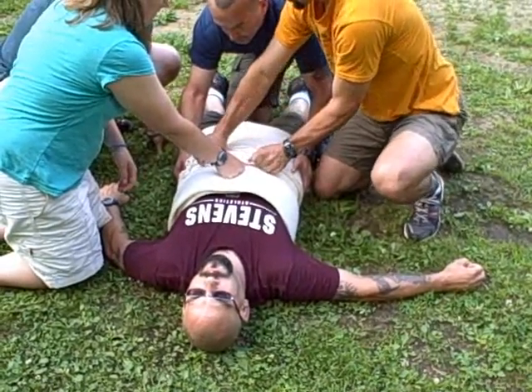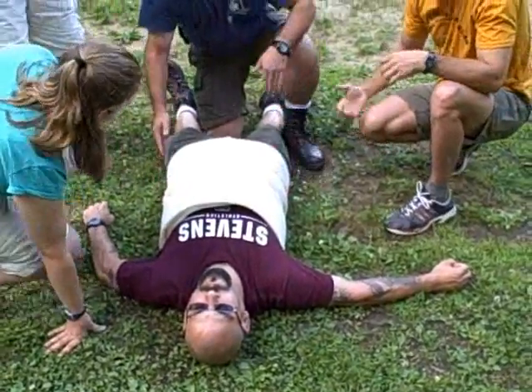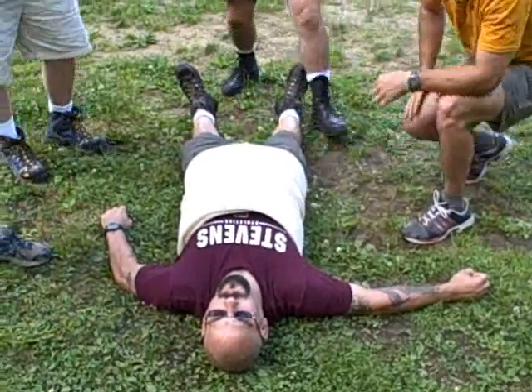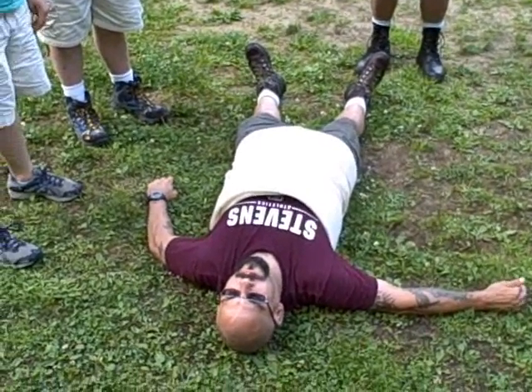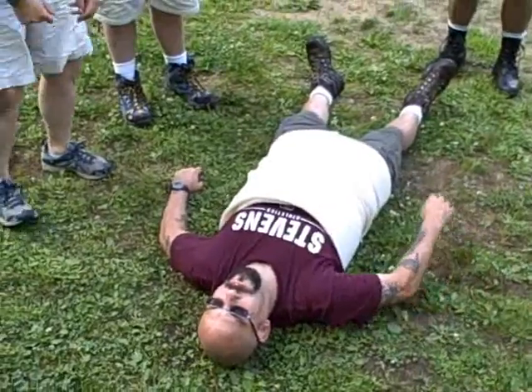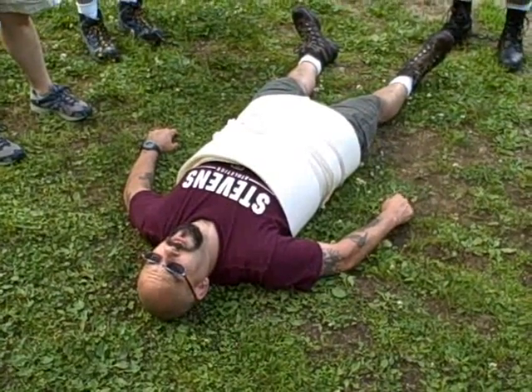Ivan, do you feel like they've taken the tension from your hands? Yes. That splint has replaced your hands? Yes, sir. Excellent. So this is just a simple example of a gentleman who has fallen and had a fractured pelvis — closed the pelvis, held it still, and simply, using an enslide pad, wrapped that around with a couple of cravat ties to tie it in place. Jerry, you comfortable? Yes. Excellent. Thank you, team.